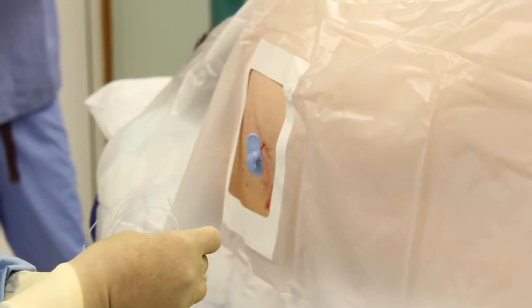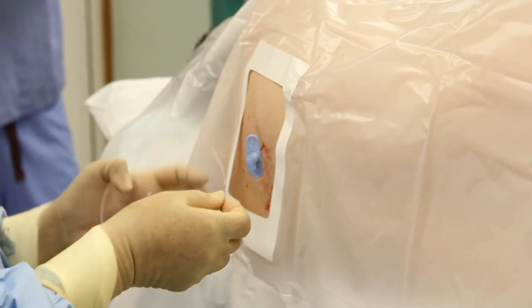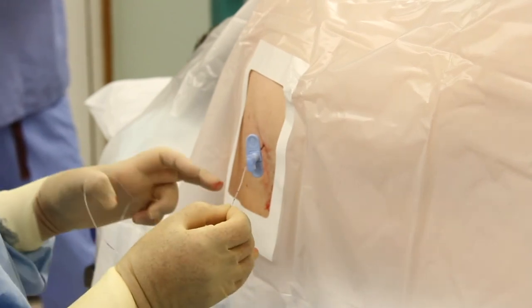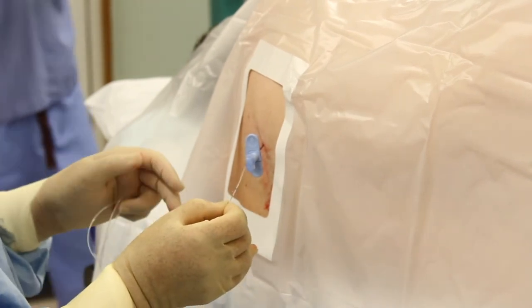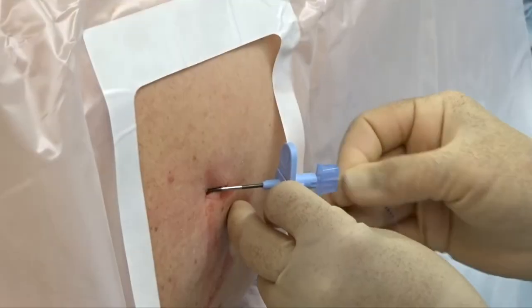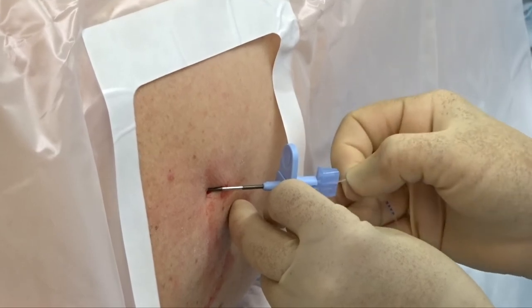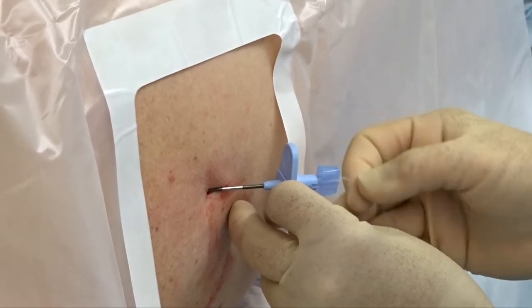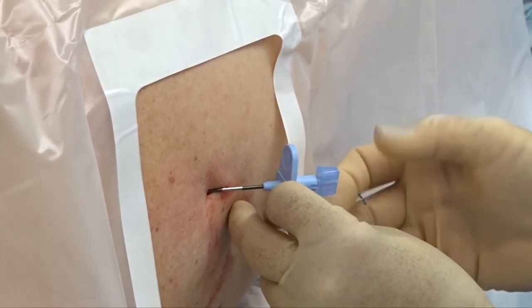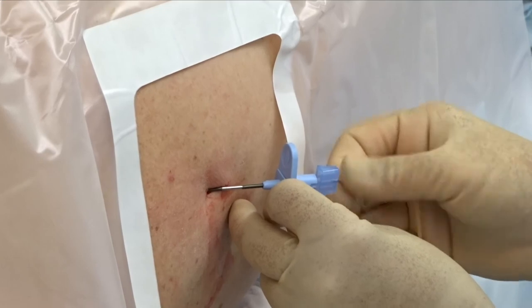Having detached the syringe, we can then introduce the epidural catheter via the needle, advancing it an additional four to five centimetres beyond the tip of the needle so that it lies safely within the epidural space.